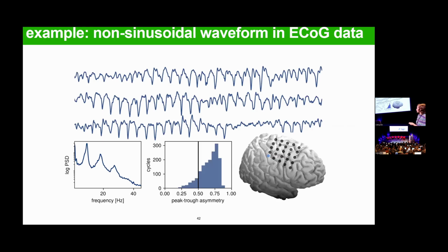So this is just for beauty, to show you that this is an actual thing that happens in real brains. Here you see a nice rhythm that's recorded over the sensory motor region, and it has these very distinct arc-shaped oscillations. So these will definitely generate also peaks in the beta band, and even higher harmonics.